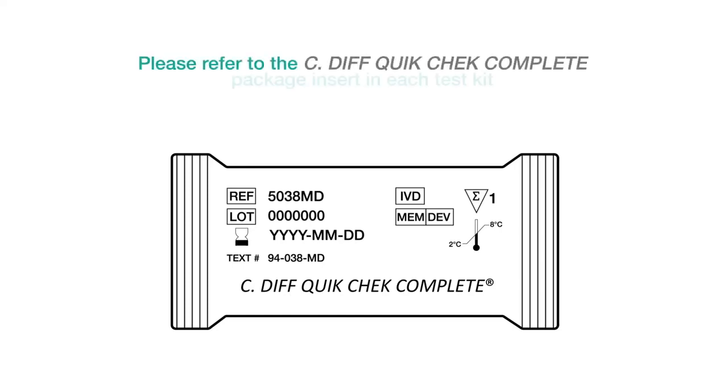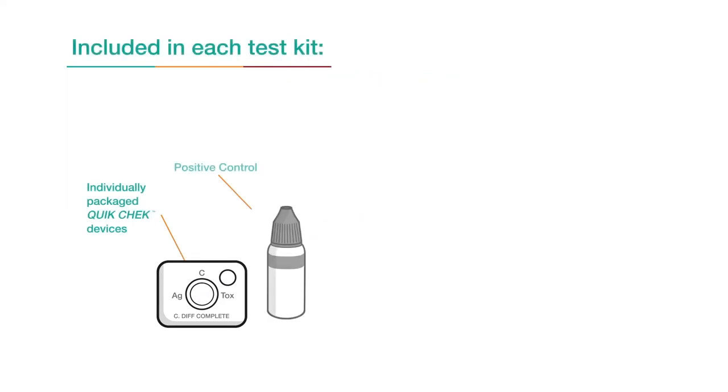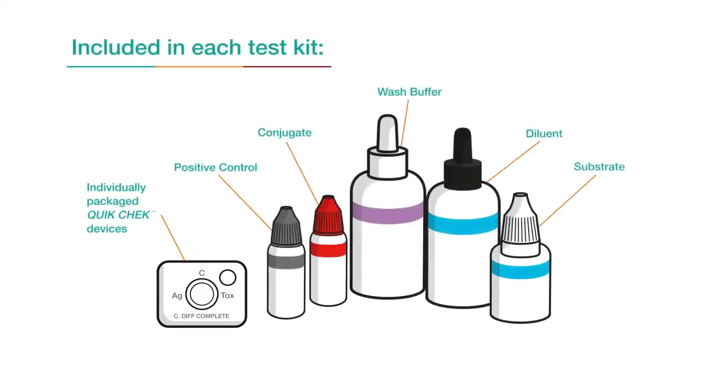Welcome to the Tech Lab C-Diff Quick Check Complete product demonstration. These materials are included in each test kit. Refer to the package insert for additional materials that may be required.